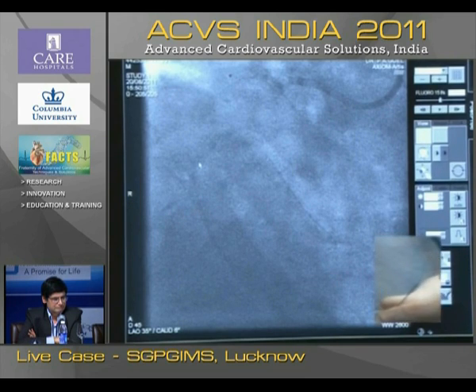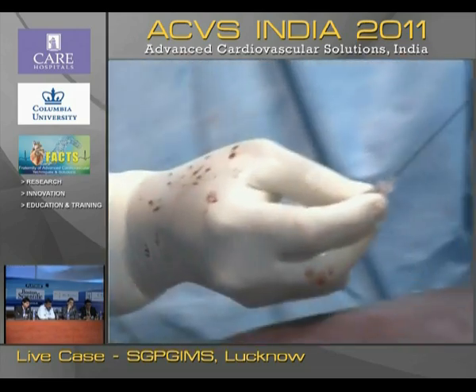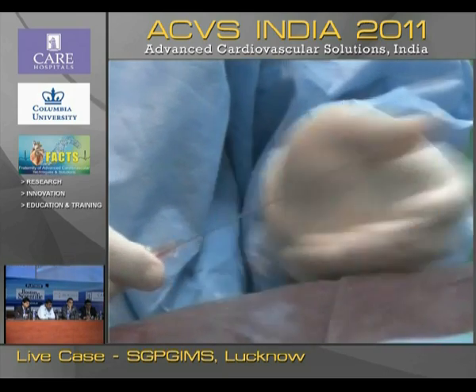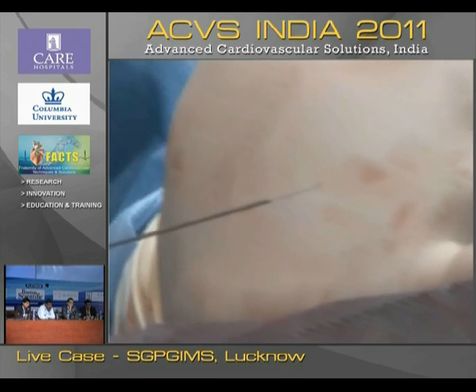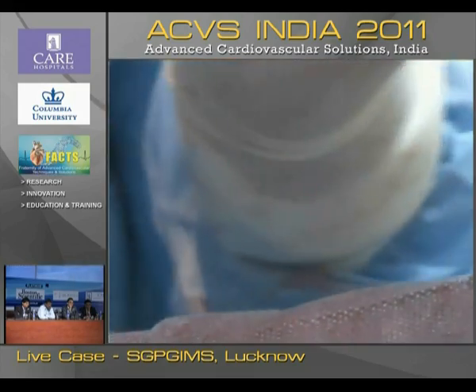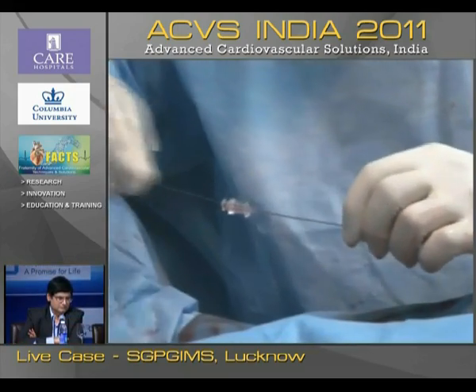I don't know whether you can see it. Can you zoom in and show? Yeah, can you show this please? Okay, so that's better. So there is a 15-degree bend proximally, and there is about a 45-degree bend distally, only in 2 millimeters. Because now the proximal bend will help me redirect the wire, by changing how much it is outside the guiding, how much it is outside the microcatheter, and how much inside.